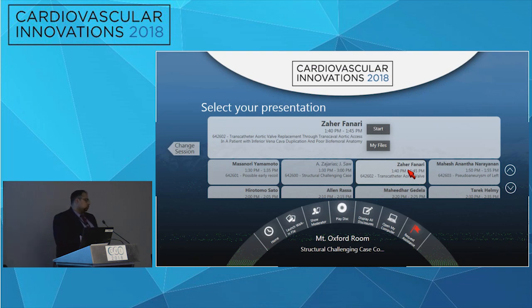We do them either subclavian, and if that is too deep, carotid. Why not carotid in this case? We as a center never did carotid, so we just did not feel this case. She had a very short neck also, and a lower bifurcation, and we did not feel like this should be our first carotid case.